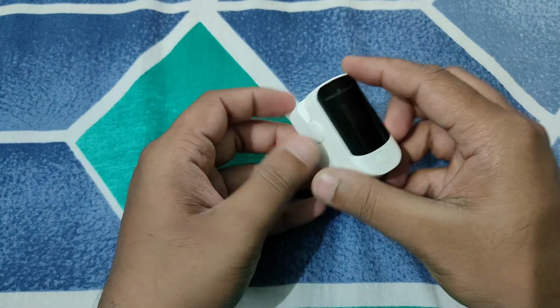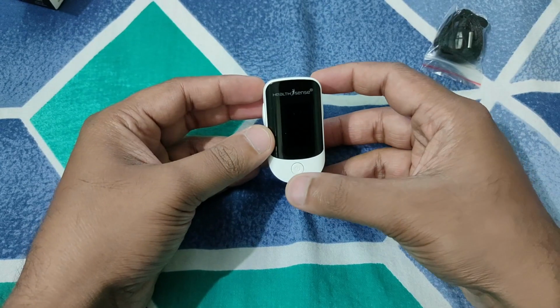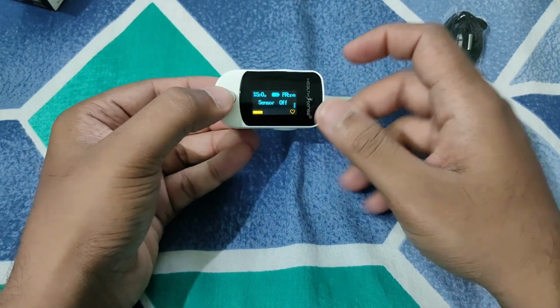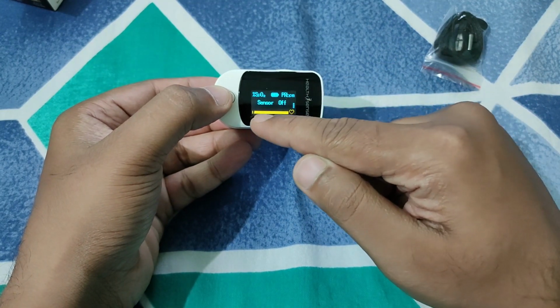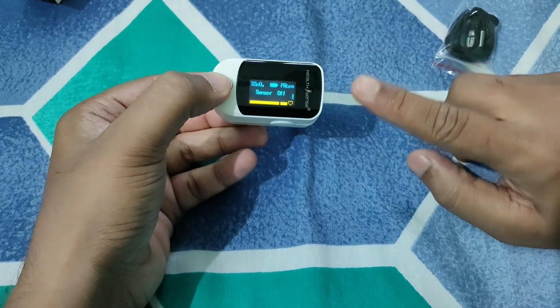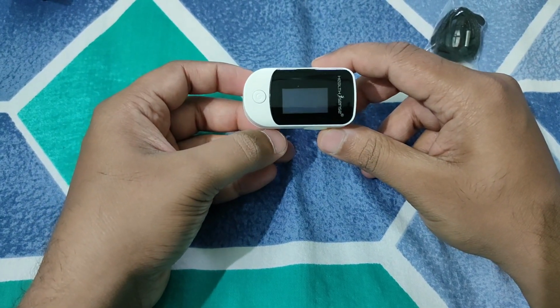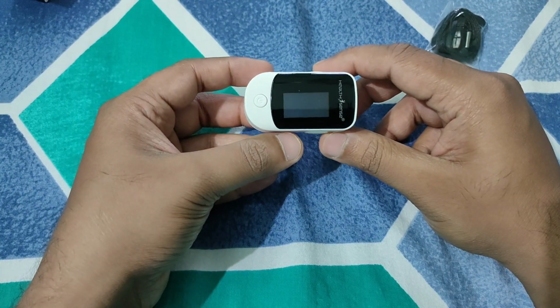Close it from here. Let's switch this on. You can see it's written Pulse Oximeter. There is the percentage of SpO2. This is the battery percentage. This shows that the sensor is off because there is nothing inside the sensor. Let me put my finger here. It also has auto-off technology, so if you don't put your finger in for 5 seconds, the device will switch off on its own.